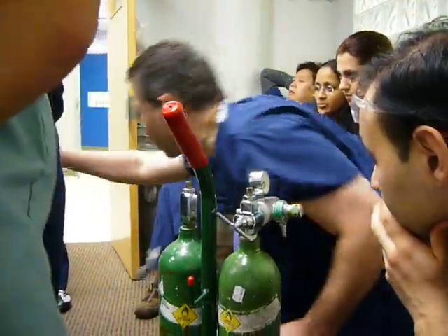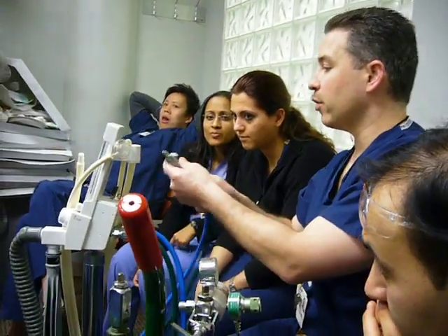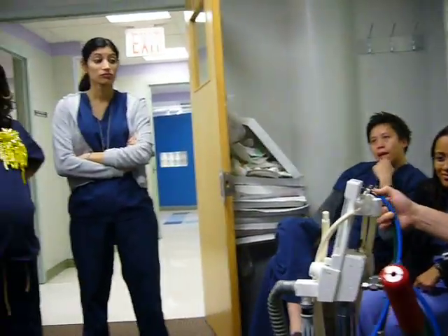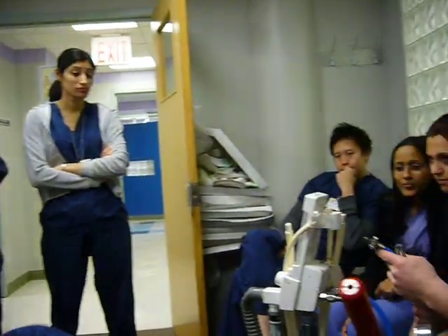Alright, anybody have any questions on how to use this machine? Now to hook the piece into the wall, it locks in itself. It's got the little latch here. Blue is nitrous oxide, green is oxygen.